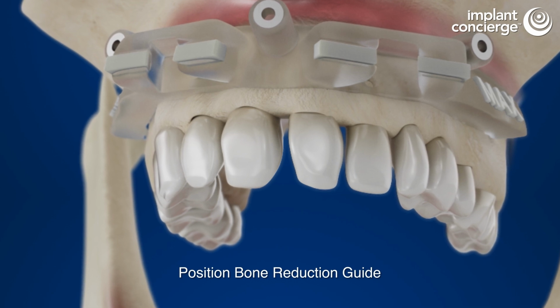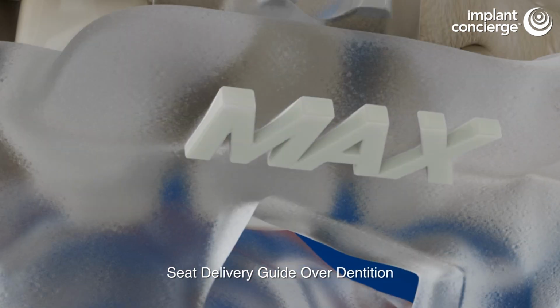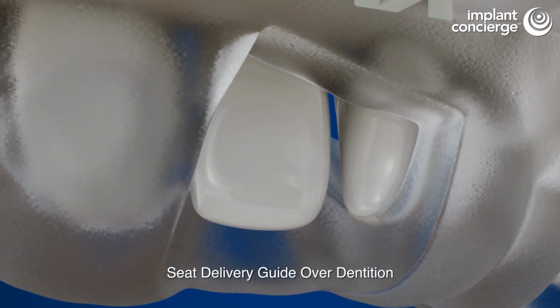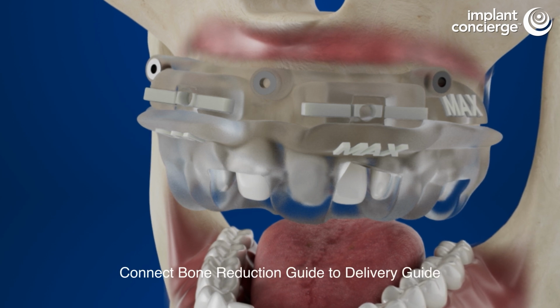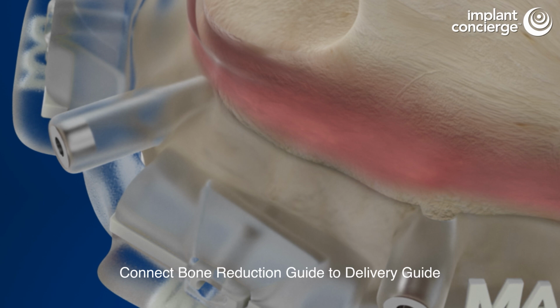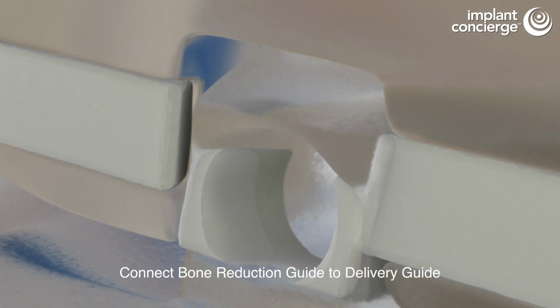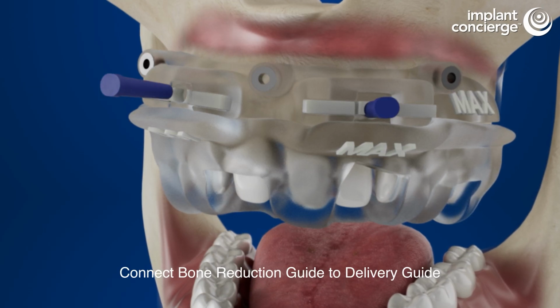Next, seat the delivery guide over the dentition and utilize the anatomical verification windows to ensure that the delivery guide is fully seated. Then, connect the bone reduction guide with the delivery guide. Verify that the bone reduction guide intimately fits to the buccal bone with no tissue impingement and check the indicator lines. Secure the guides with the blue pins.